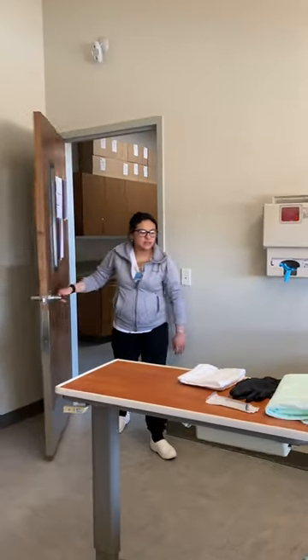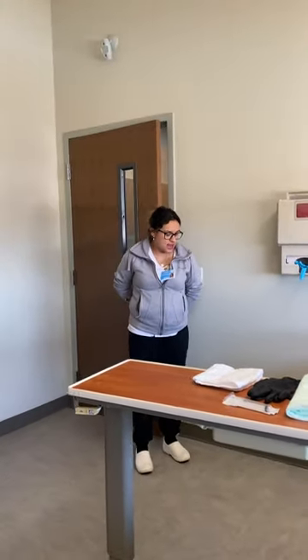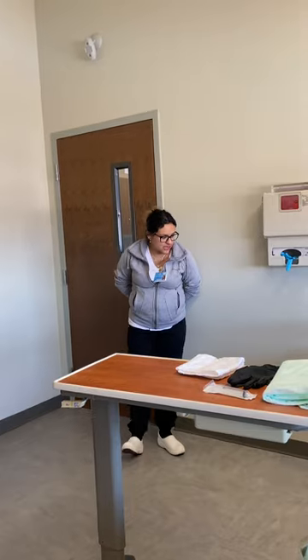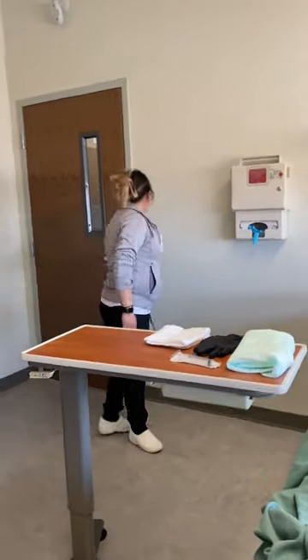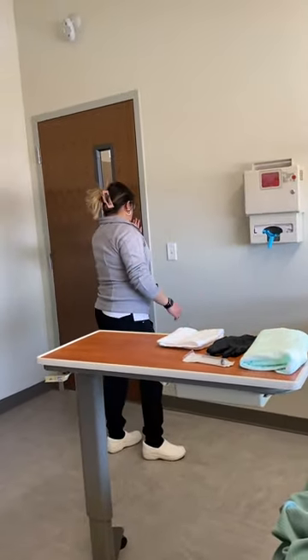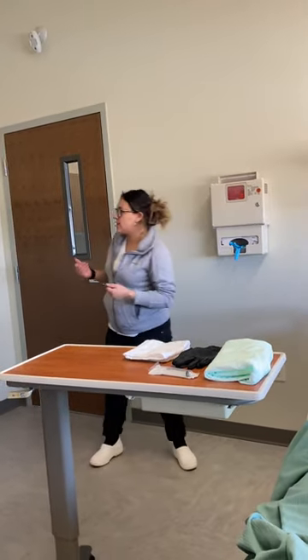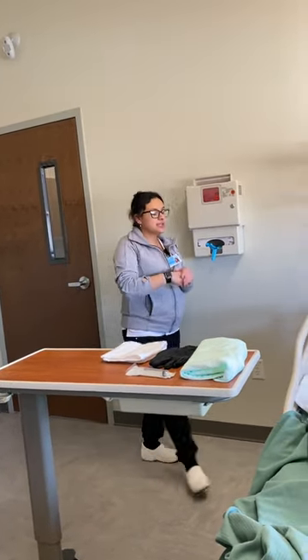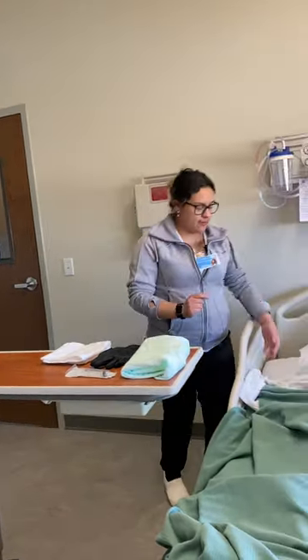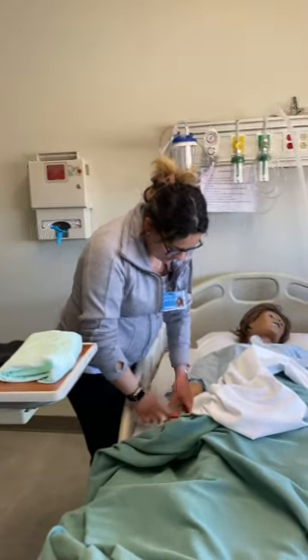Hello Mrs. Smith, my name is Theory and I am your nurse for today. Before I begin and explain the reason why I'm here, I'm going to go ahead and sanitize my hands and I'll have you verify your name and date of birth with me.